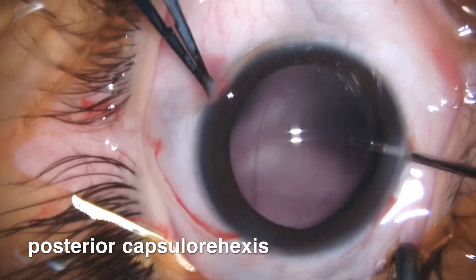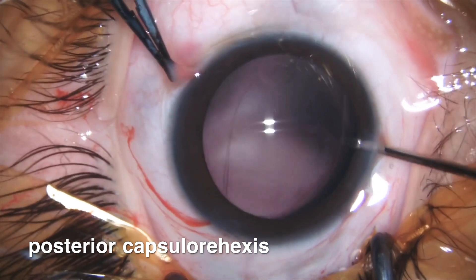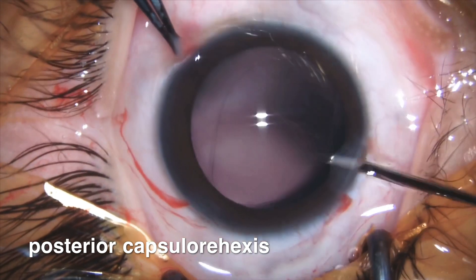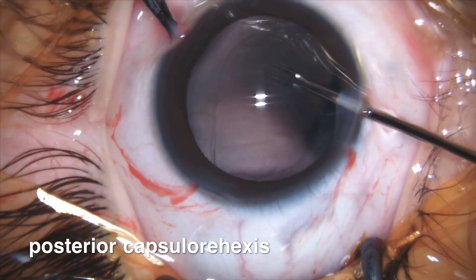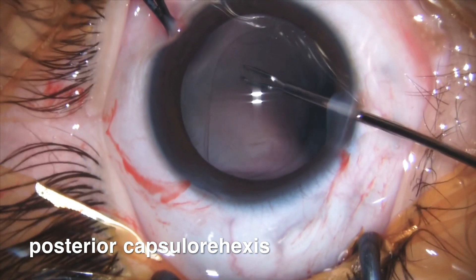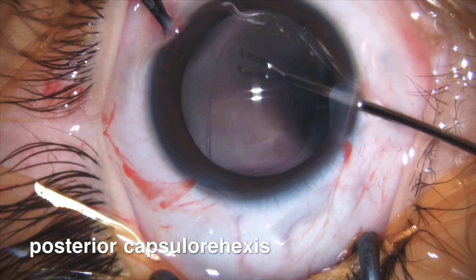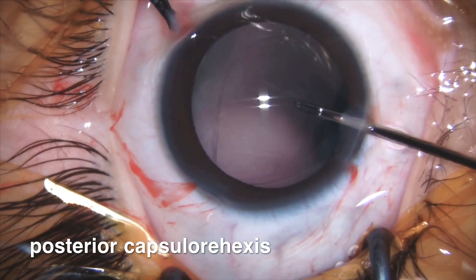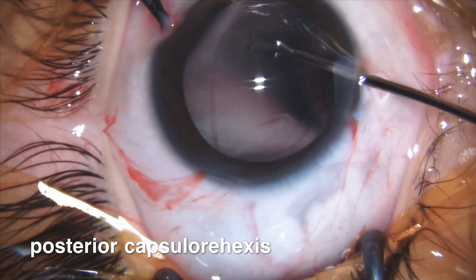I usually enter the bag with OVD. It gives me a good view and makes it easy to reach the posterior capsule.